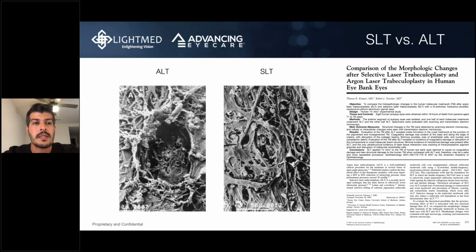If there's a patient that comes and says, and I look at the pressures and I see the pressures are excellent, except the patient complains, these drops burn, I forget them, I travel a lot, I forget to take it. Well, that's exactly the type of patient I'm going to take off the drop. I'm going to do a quick washout period, and then I'm going to schedule them for an SLT. But just because you're going to do an SLT doesn't mean you have to discontinue the eye drop. It depends on how they're doing with the eye drop, what's their pressure as it is with the eye drop, and what's your pressure goal.